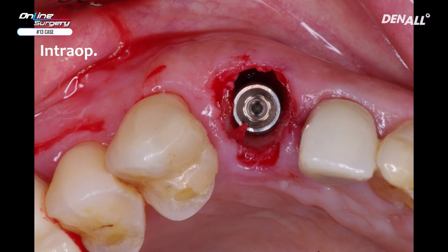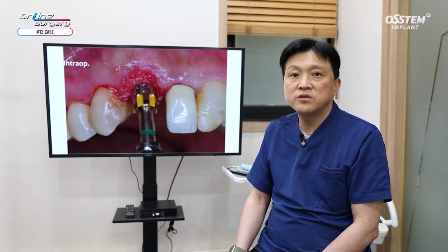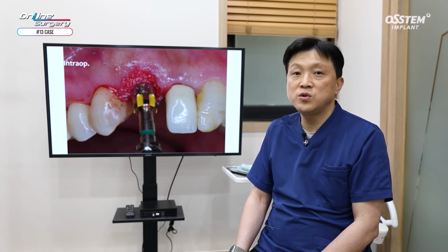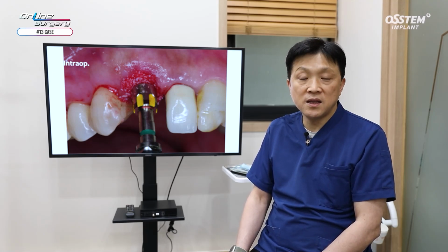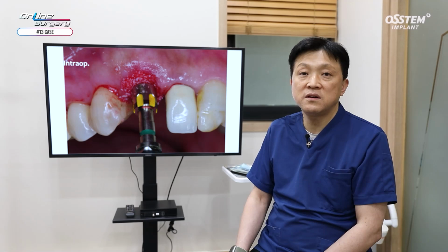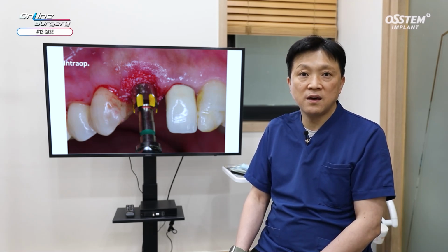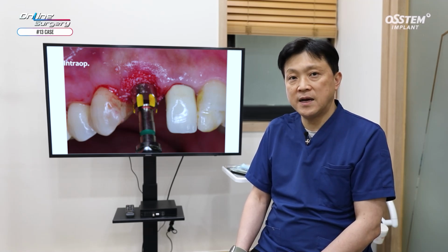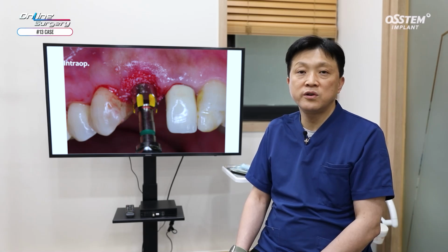You can see that there's significant buccal gap after implant placement. A Oss collagen was used for bone graft. The reason why A Oss collagen was used was because if you take a look at dual zone concept mentioned by Salama, there's a bone zone and a tissue zone. If you use a bone graft material not only in bone zone but also in tissue zone more so than augmentation, it helps in preventing collapse of tissues. This is what is called dual zone graft concept.